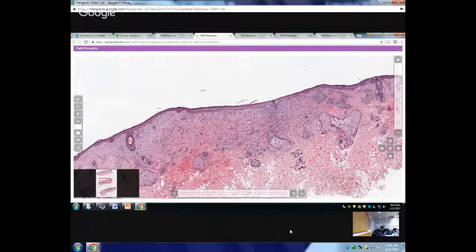In the comment you say that although the features look like a trichoepithelioma, I cannot rule out a microcystic adnexal carcinoma, go back and rebiopsy. In short, you might not even want to put trichoepithelioma. You might just say you cannot even rule out an infiltrating basal cell carcinoma, go back and take it out. What is more important is you have to ask the clinician to go back and make sure that the entire lesion is completely excised.